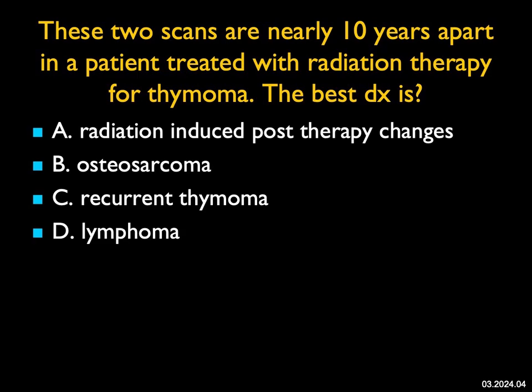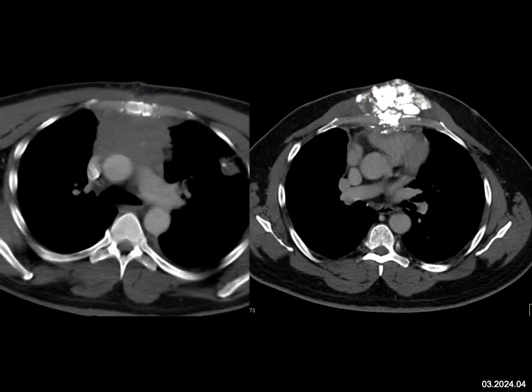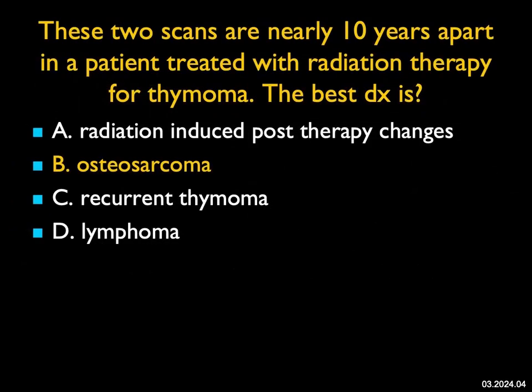These two scans are nearly 10 years apart in a patient treated with radiation therapy for thymoma. On the image on the left you see an anterior mediastinal mass — that's a thymoma. On the image on the right, the thymoma is gone but there's a large mass anterior to and involving the sternum. It doesn't look like recurrent thymoma. What I see is a very dense matrix involving the sternum and the soft tissue anterior to it. One complication of radiation therapy — fortunately uncommon — is developing a sarcoma, either chondrosarcoma or osteosarcoma. This was an osteosarcoma, post-radiation for thymoma, presenting a decade later.